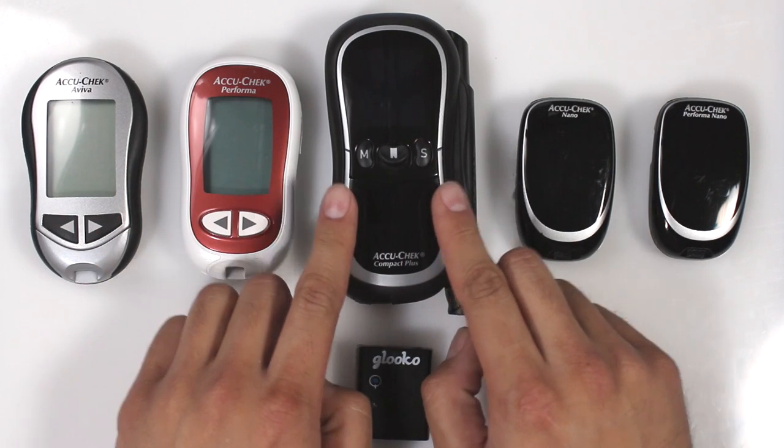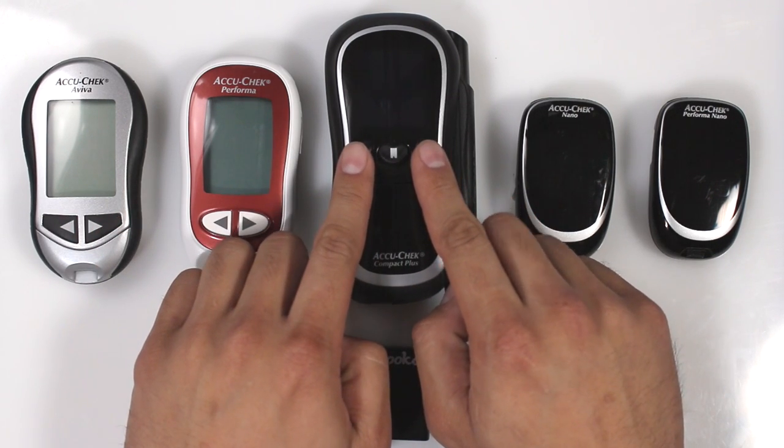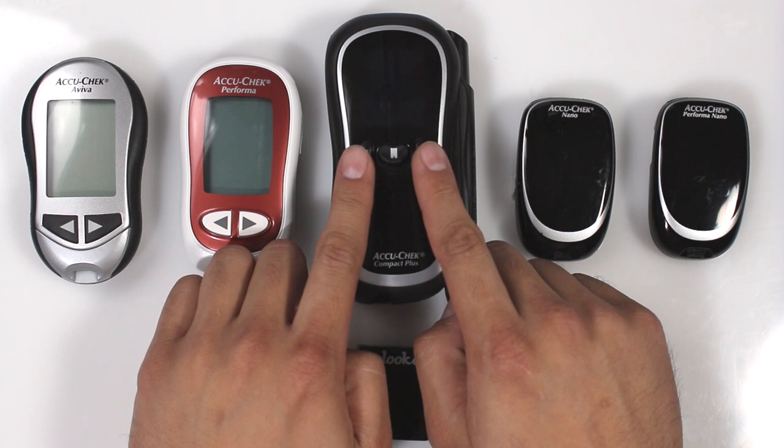For the AccuCheck Compact Plus, press and hold the M and S buttons until you see Sync icons appear on the screen.